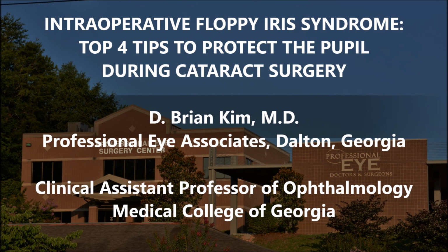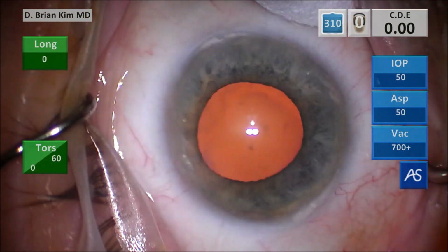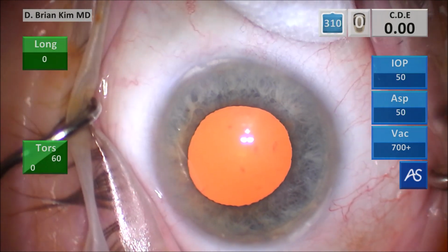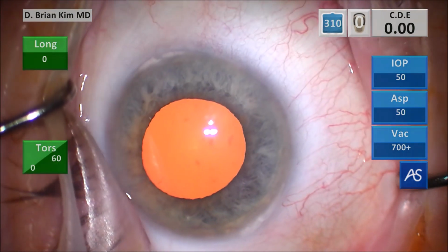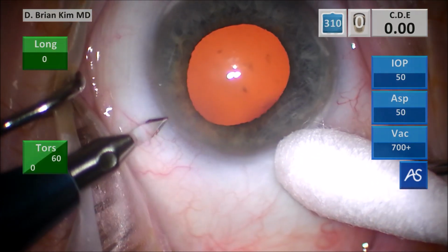So I'm using a cotton tip to straighten the eye, and then using a corneal marker, which will help me to center and size my rhexis. And then I'm going to make my paracentesis incision, first on the right side and then the left side. And make sure the incision is parallel to the iris plane, which creates a nice corneal shelf, which will allow me to achieve a self-sealing incision.